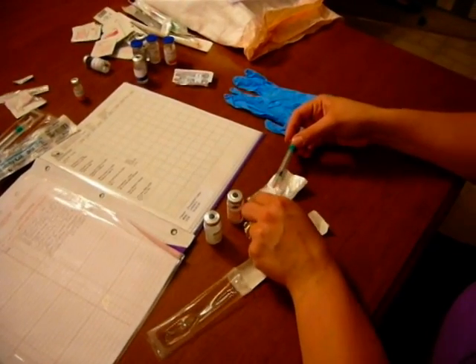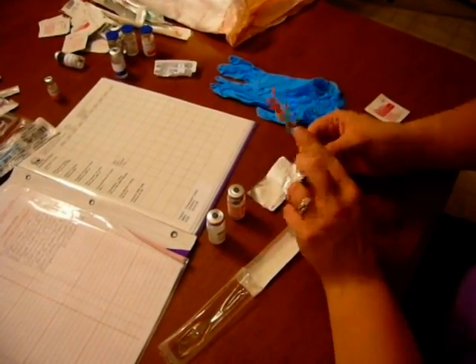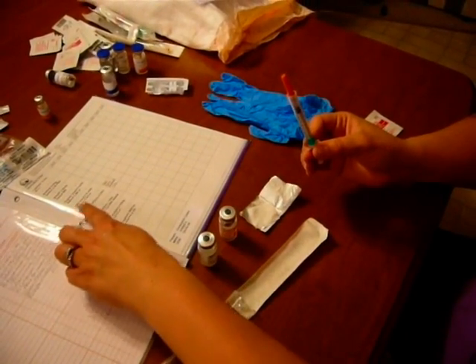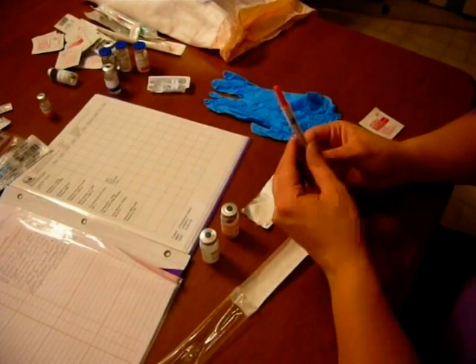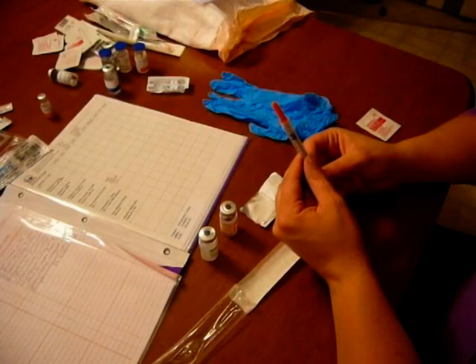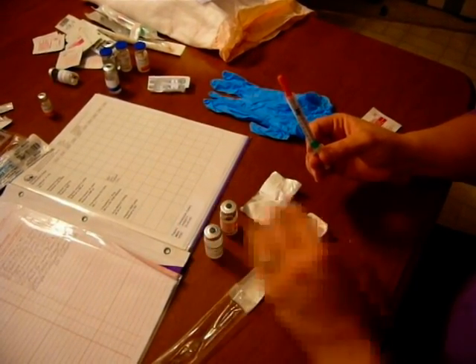The last thing I'm going to do is recap my needle to make sure I'm ready for administration. I'm going to check that I have 24 units total. I'm going to check my patient's glucose to make sure they're able to receive this insulin and that their glucose level can handle it. And that's mixing insulins — regular and NPH.